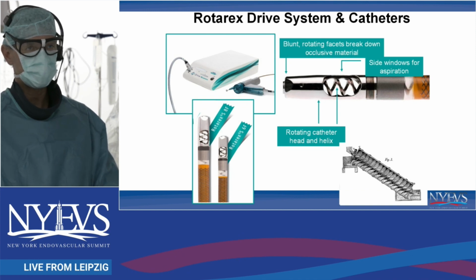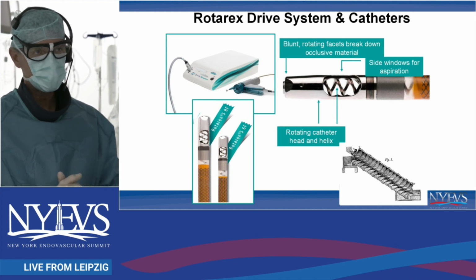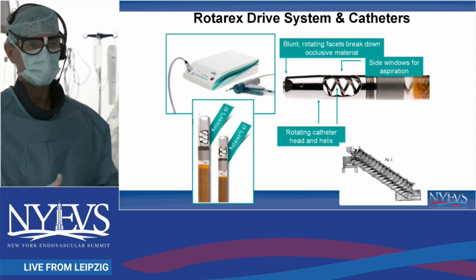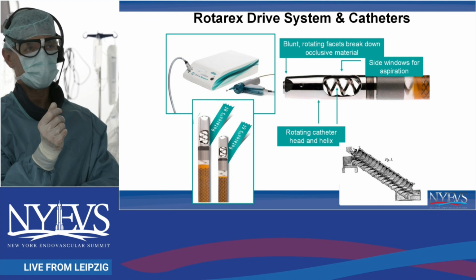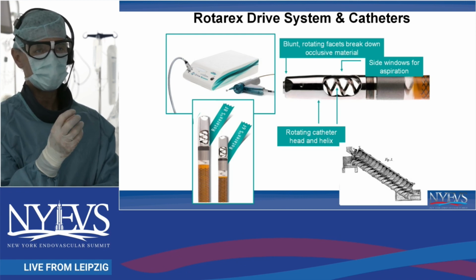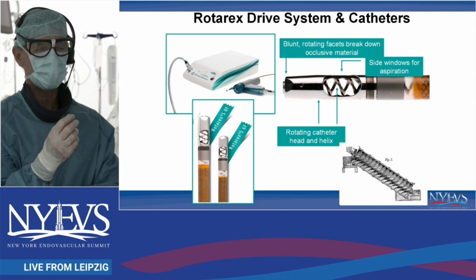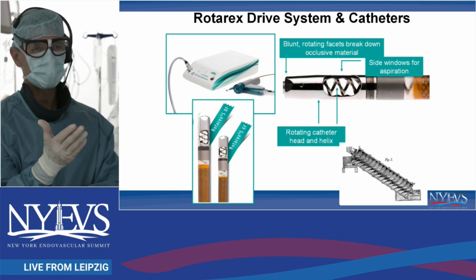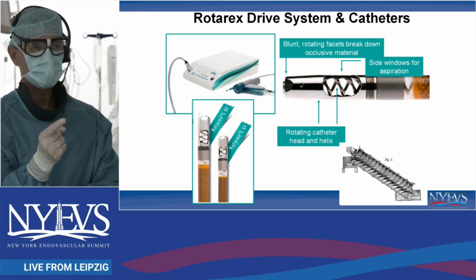So you see the Rotarex device, for those who do not know this. It's available in 6, 8, and also now in 10 French. For stents it is actually for us always 8 French, for iliac stents 10 French. It's a very flexible catheter, can go nicely crossover, with a tip which spins and rips off the material, and the spiral inside of the catheter rotates very quickly, creating a very strong aspiration force. So it works like an Archimedes spiral. And next shows you some data. Next slide.